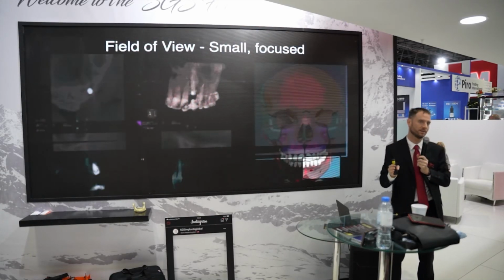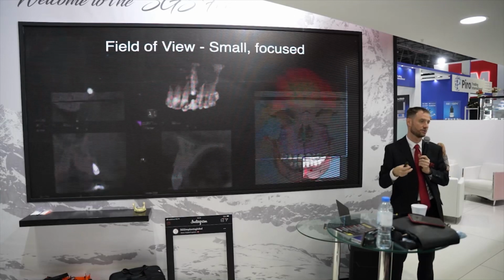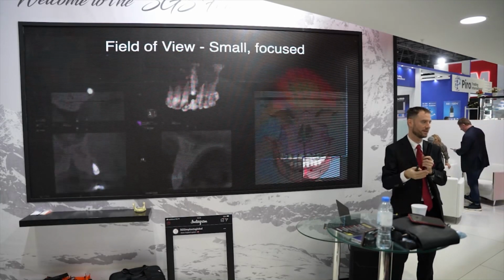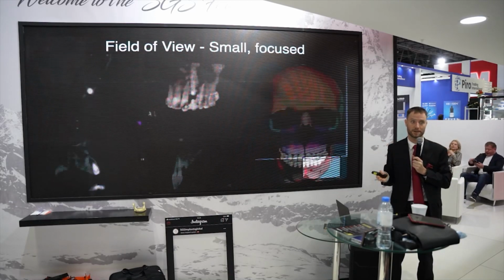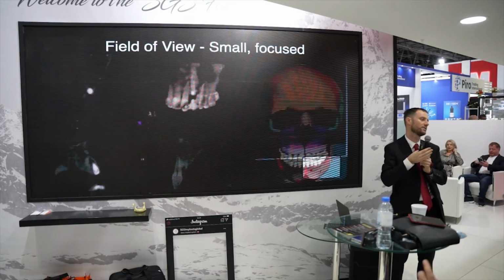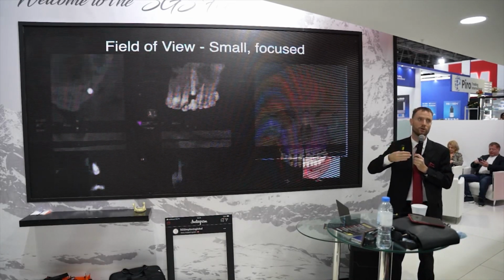Two aspects. One, you don't want to have extra radiation. Two, you're not a radiologist. You are not performing full scan of the patient. If you do a full CT of the patient, there are a lot of data that you don't analyze. But it's your legal responsibility that you know what's on the CT.